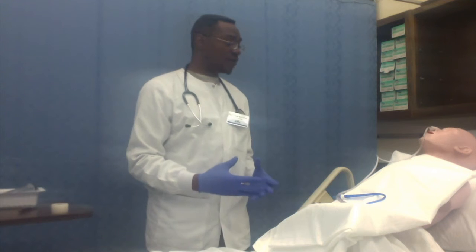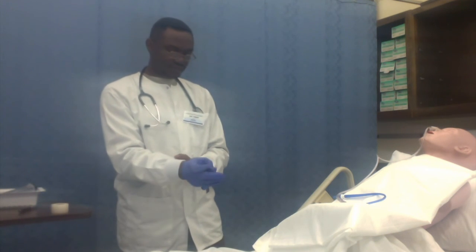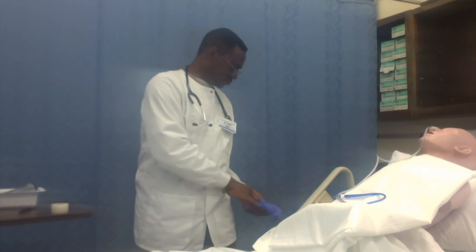Having made sure my patient is comfortably positioned, I will assess to find out how well he tolerated the procedure. If he has no pains, I will ask him to alert or signal me or call me using his call light if he wants me. That said, I will place the call light beside the patient before I leave. I will now take off my gloves and then document the procedure. Thank you.